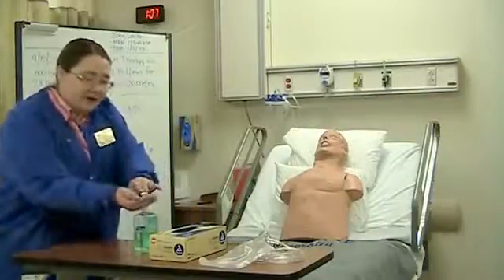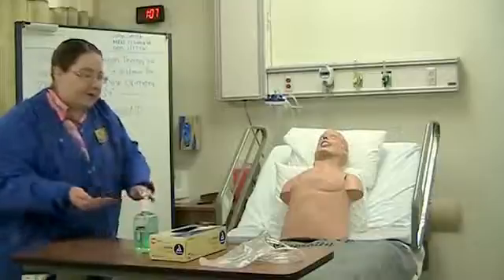At this point, I'm going to apply my hand sanitizer since it is permitted by my facility. If this isn't permitted at your facility, you would wash your hands. While the sanitizer dries, I would like to let you know that this patient is not in any isolation precautions, so today I will simply be observing standard precautions, which will be gloves for the purpose of this video.